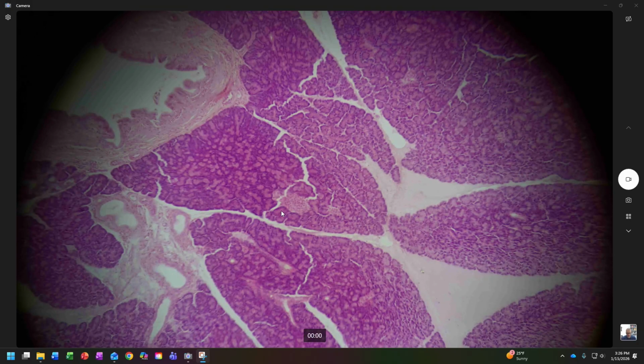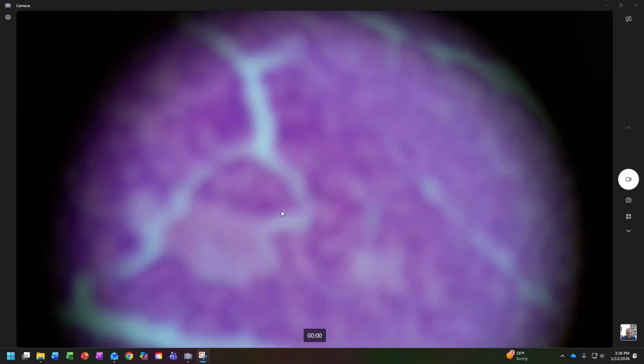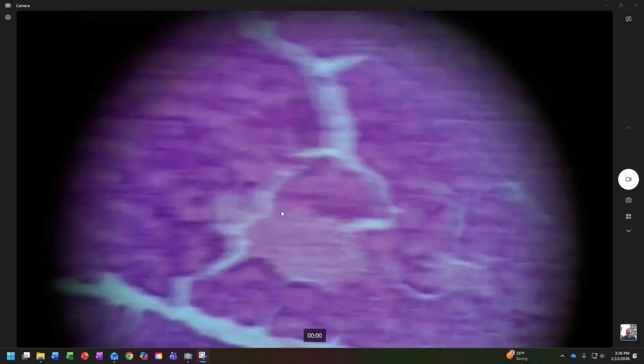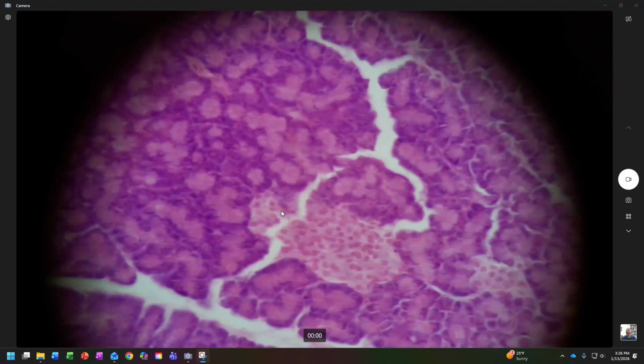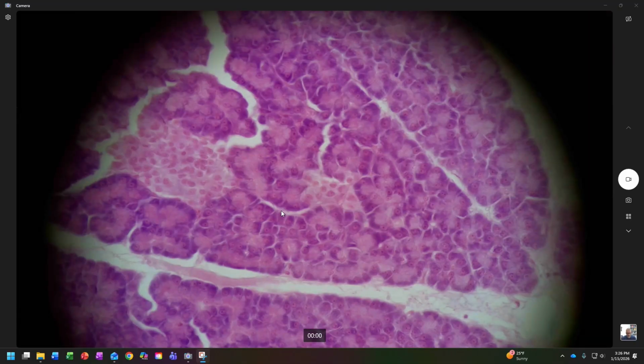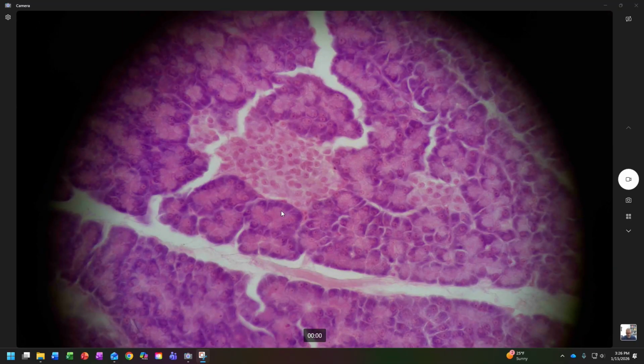Okay. Center that up, zoom in. Hopefully we landed right on it. Yep, looks like we did. Went too far. Yeah, there it is right there at the bottom left. Let me center that. Oh, and there's another one right there. So there's the one we were looking at. And hopefully you see that little small one right at about 330. So I'm looking at this one right here.